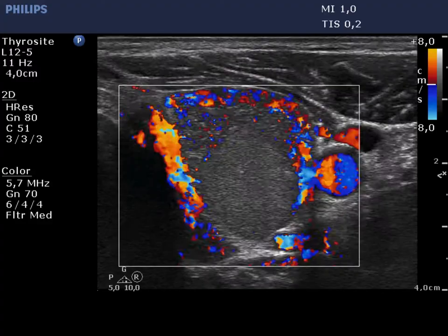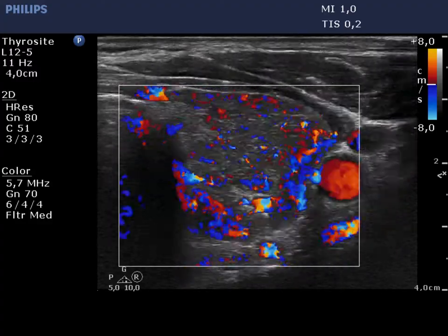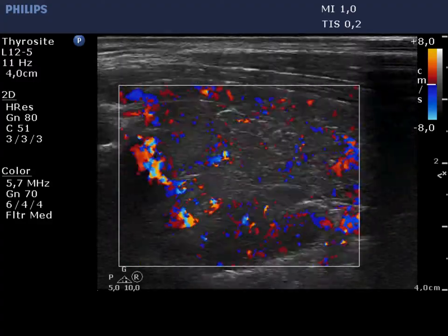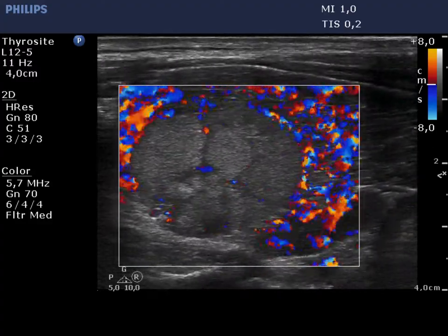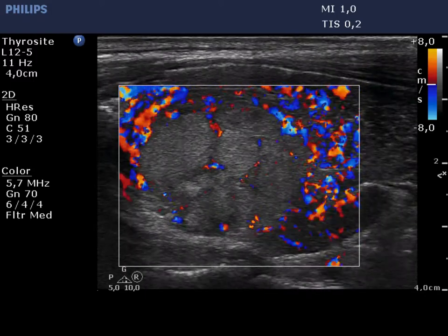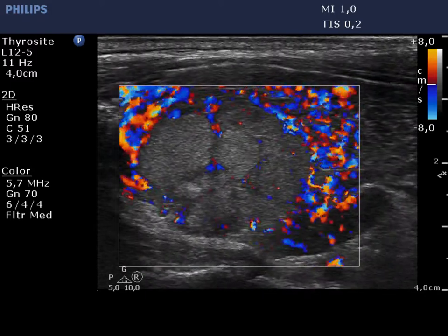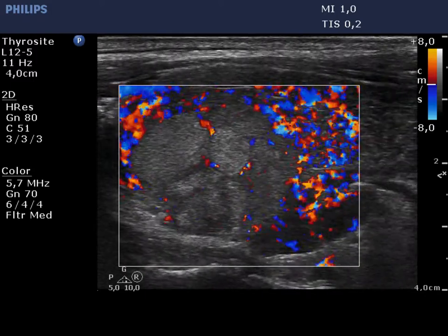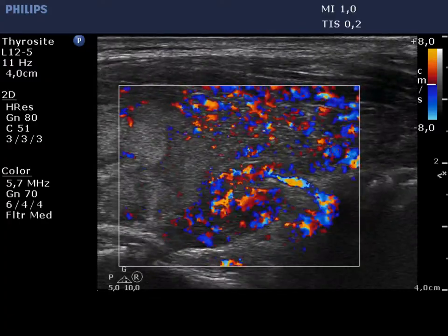The vascular pattern initially appears as though the nodule has paranodular blood flow; however, only the extranodular part of the lobe shows markedly increased vascularization — the nodule itself does not display paranodular blood flow.